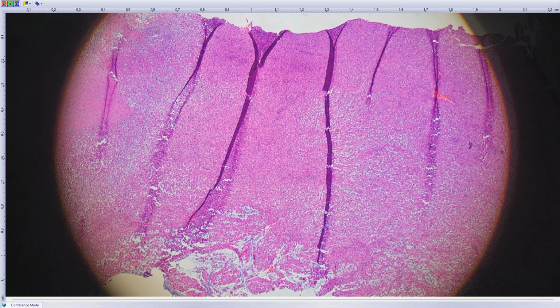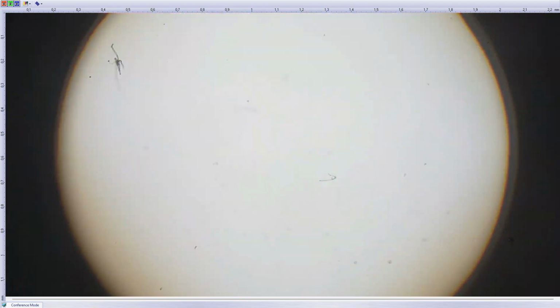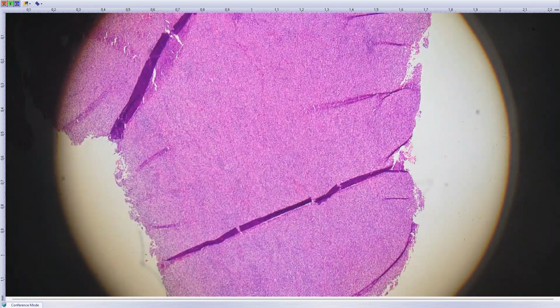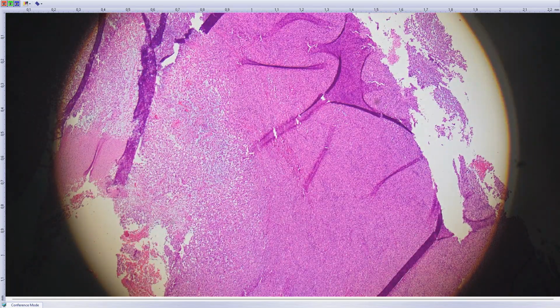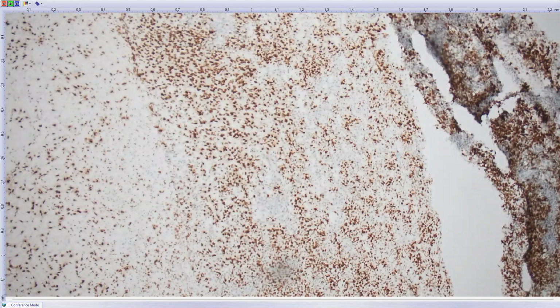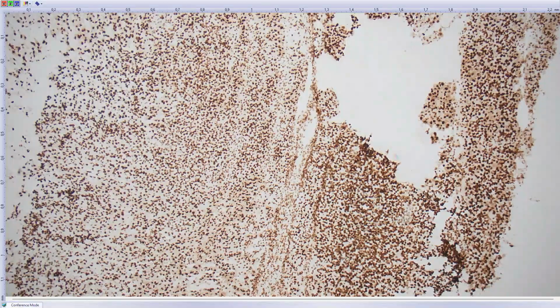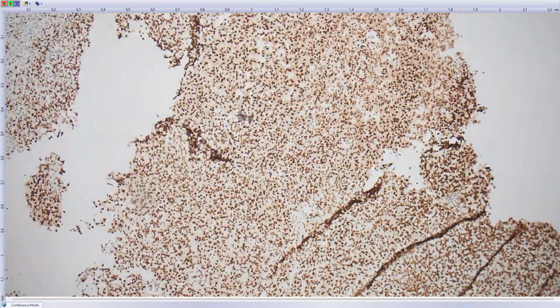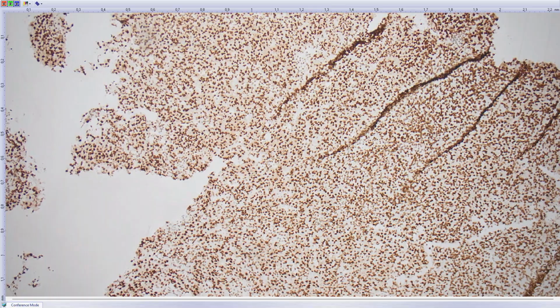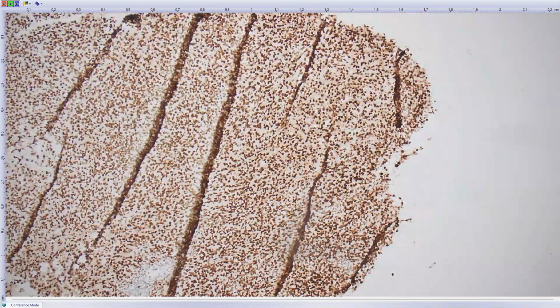Everything I mentioned so far was negative, and definitely in any neoplasm like this, which is an older patient with a pleomorphic, weird, undifferentiated sarcomatoid tumor, it's good to add this marker. Any guess what this is? MDM2. Yes, this is MDM2. I didn't do FISH because this is as positive as it can be. So this is almost certainly an MDM2 amplified neoplasm in this location.